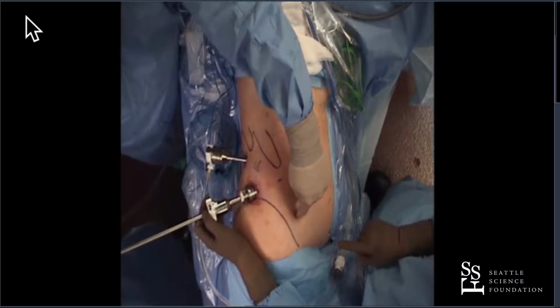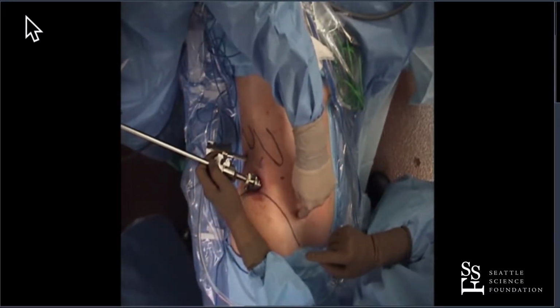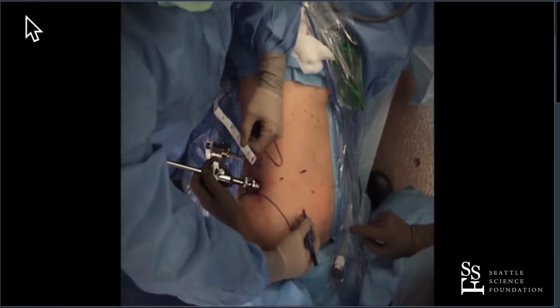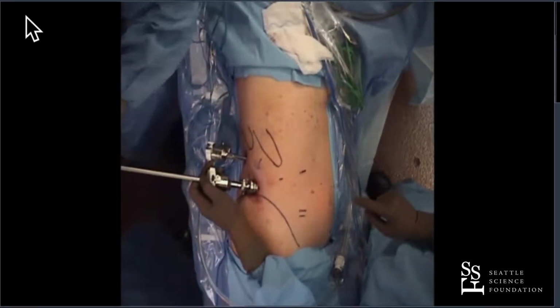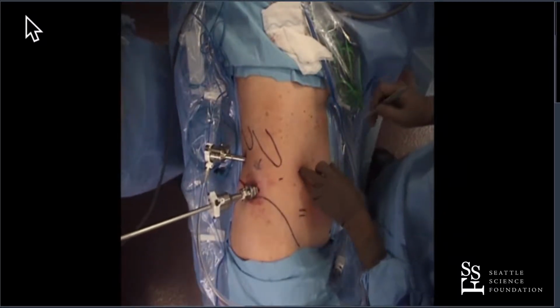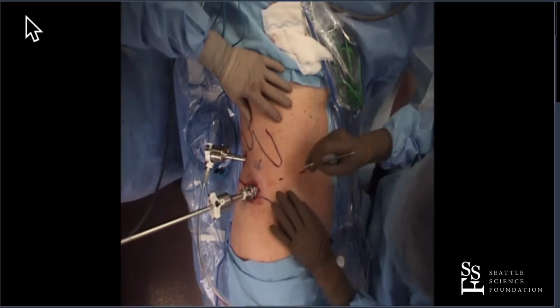Let's just see, Terry. Look down a little bit, doctor. Oh, yeah. We're good. Maybe we'll move a little cephalad. You don't need that much room, do you, Brando? No. Okay, that's better. So now Brando's going to put ports in. Thank you, Terry. Go ahead. And these are 8mm robotic ports.